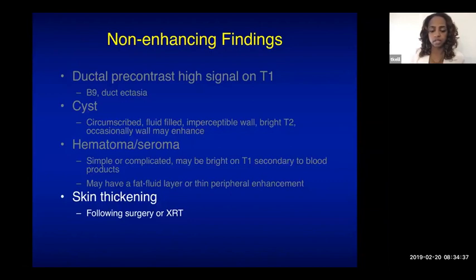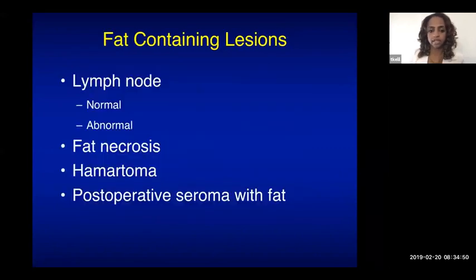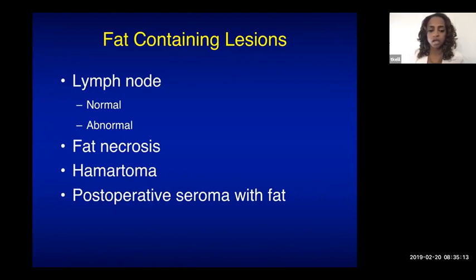Skin thickening from prior radiation is another non-enhancing finding. Fat-containing lesions include lymph nodes — normal or abnormal based on morphology and size, identified by their fatty hilum on T1 — fat necrosis, hamartoma, and post-operative seroma containing fat.